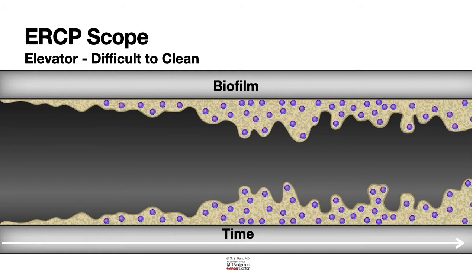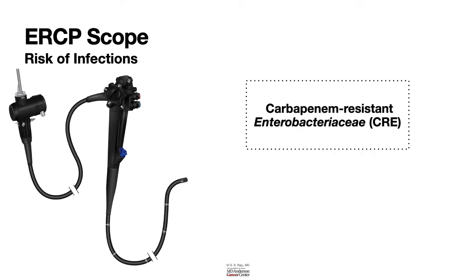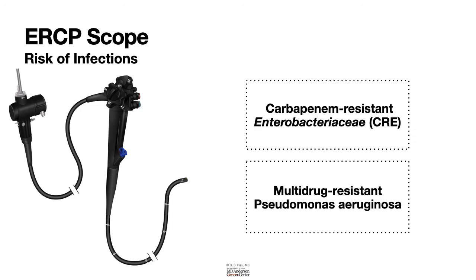And because of this, ERCP scope has been associated with a couple of serious infections. One is CRE infection, that is carbapenem-resistant Enterobacteria infection, a lethal infection. People have died from this type of infection. And another one is the multi-drug resistant Pseudomonas aeruginosa infection. And because of this, the FDA has come up with strict guidelines about how to clean the scope.